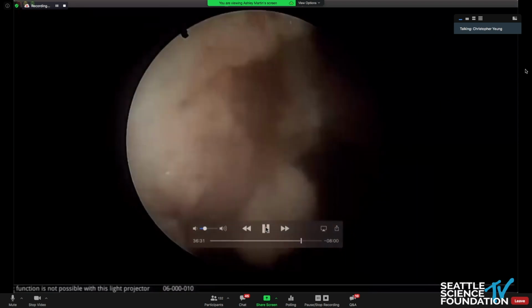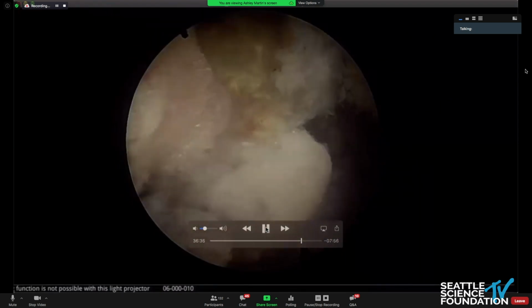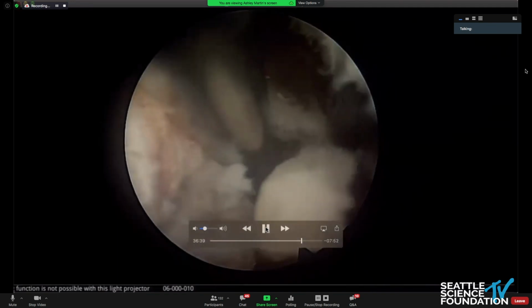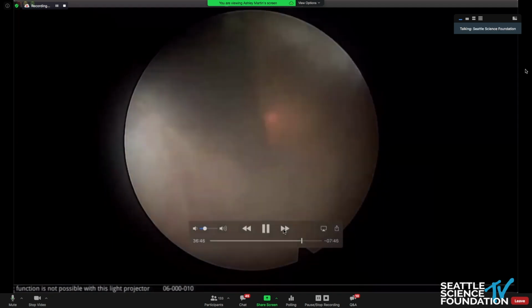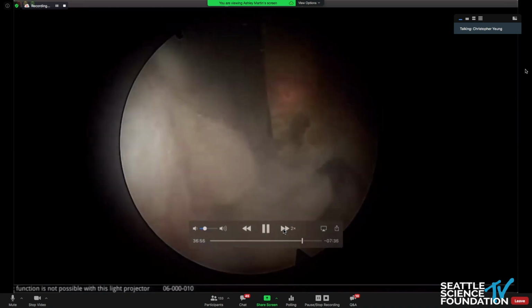There's 8 more minutes to this video, but I'll fast forward it a little bit more. This whole piece. Trying to ablate this. I think we got to start wrapping up here, Chris. Yep. This is just a good piece where you're looking at the laser working.